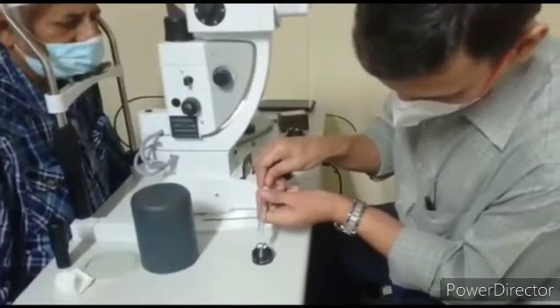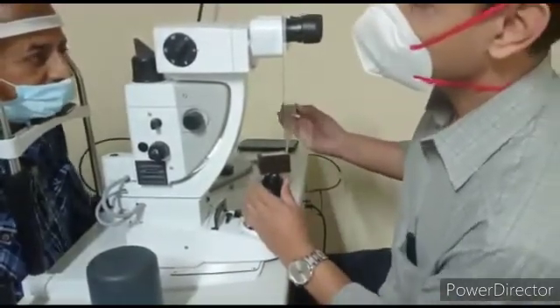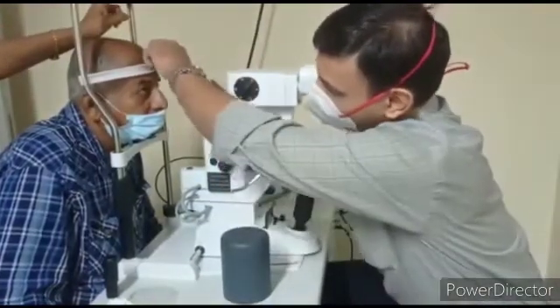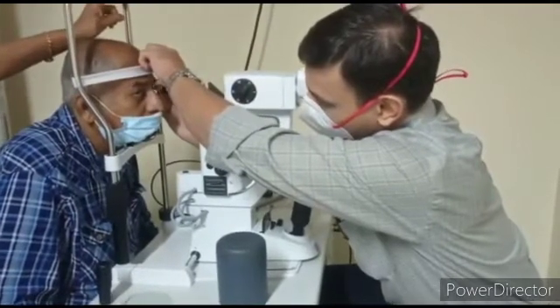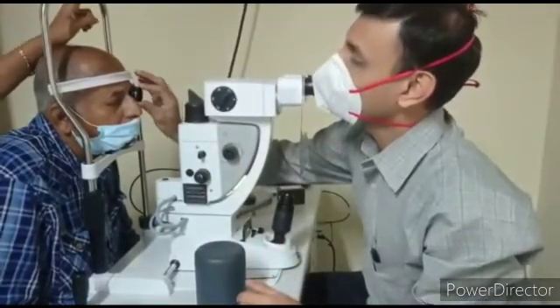So how will it be for the patient? It's a simple and short procedure. The eye that needs to be lasered is anesthetized with topical anesthetic eye drops. Then the patient has to rest their head in front of the laser setup as seen here. After this, we put a visco gel at the base of the contact lens and then place it on the eye to focus the laser beam at the proper location. Then we adjust the laser beam parameters and deliver the burns to the retina.